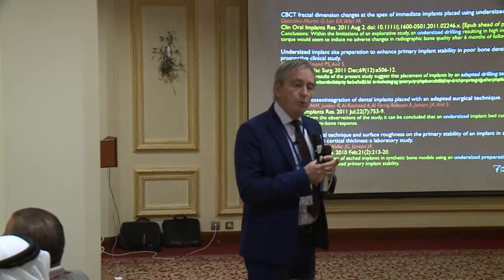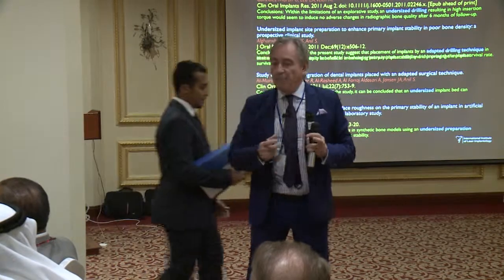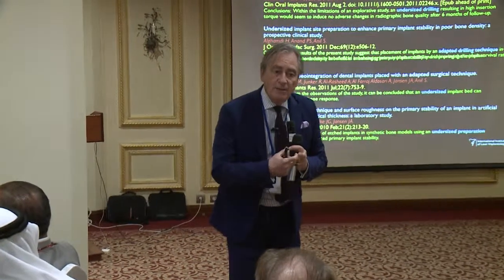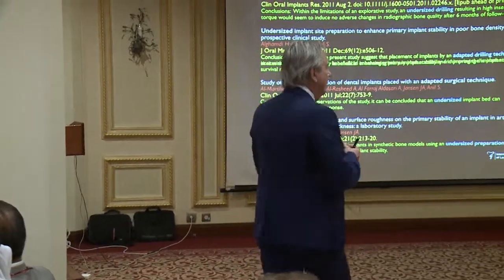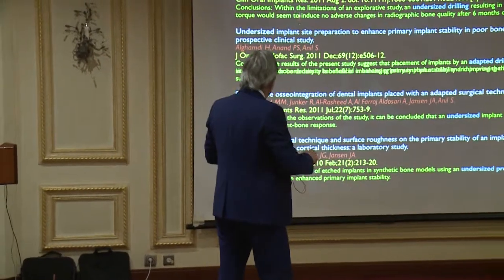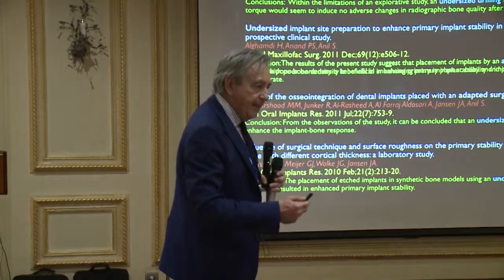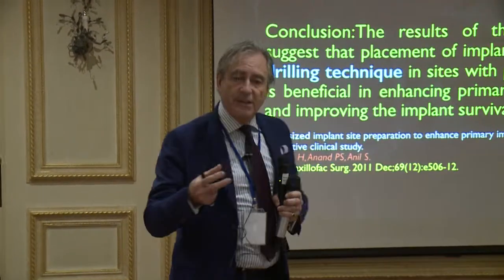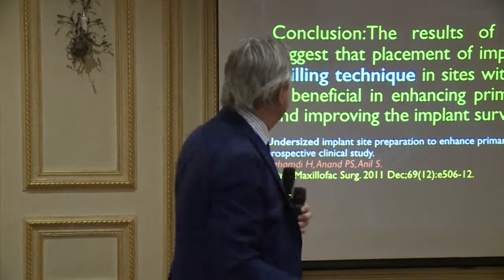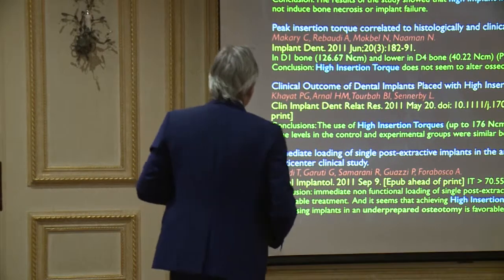If you want to gain in bone expansion, then you probably need to undersize your bed preparation. And I will end up with this, right? Different publications, again, have shown that we can undersize the bone bed preparation with good outcomes.